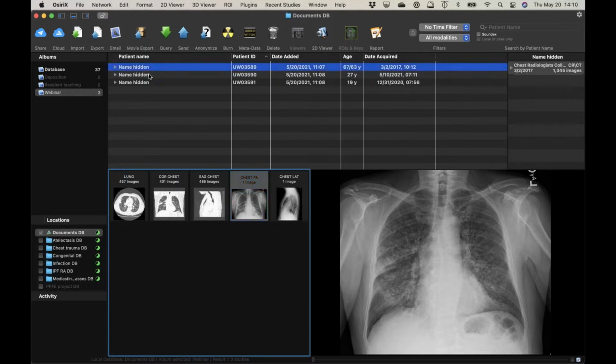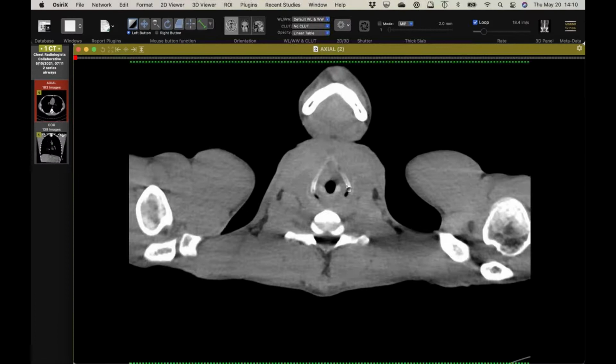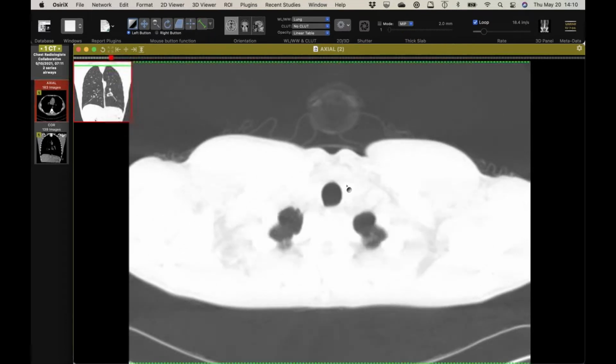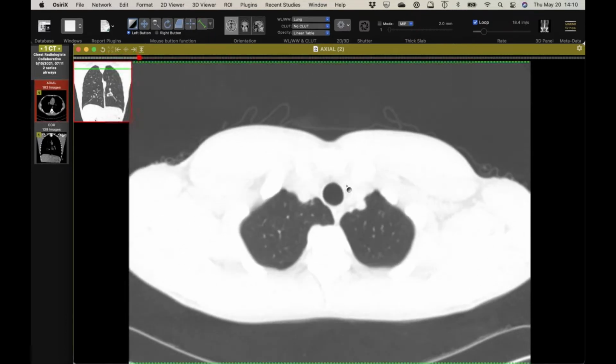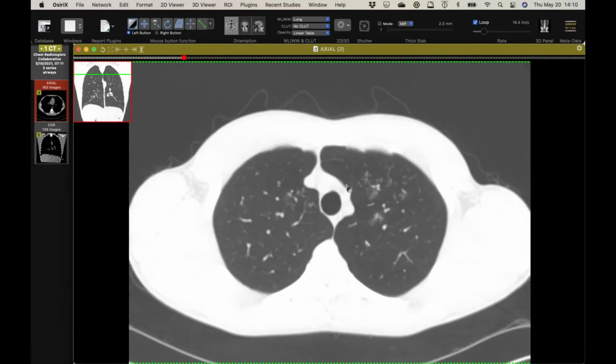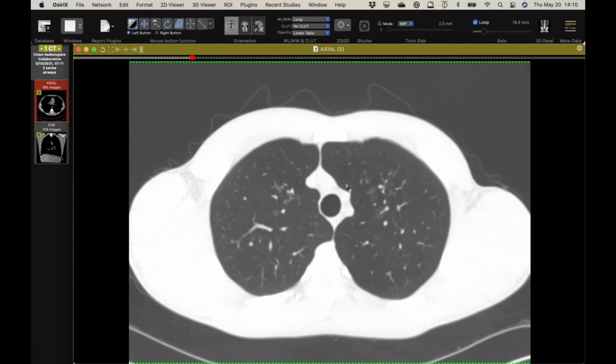Right. Okay, well, all three of my cases are related, so it's interesting, and I came across them all this week. This is a 27-year-old male. He has a history of chronic sinus disease, nasal polyposis, asthma, and an aspirin allergy, which is associated with nasal polyposis. And this is his chest CT.